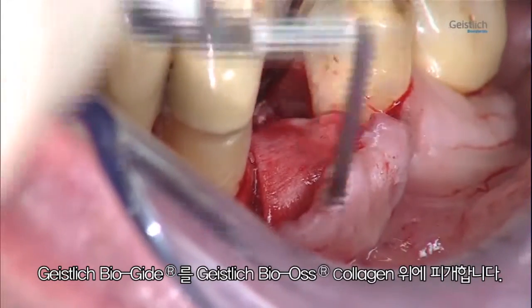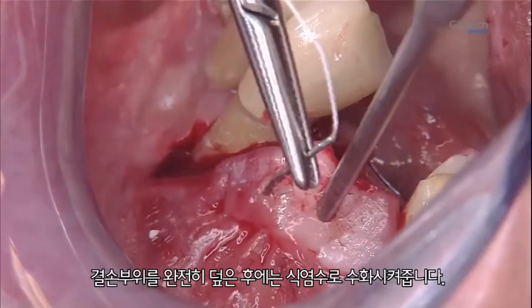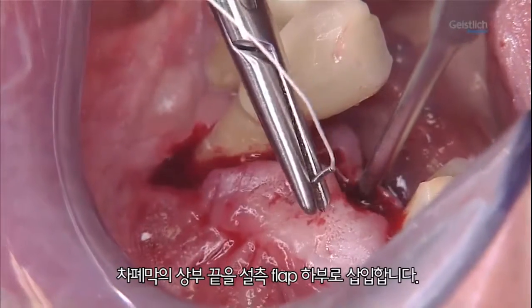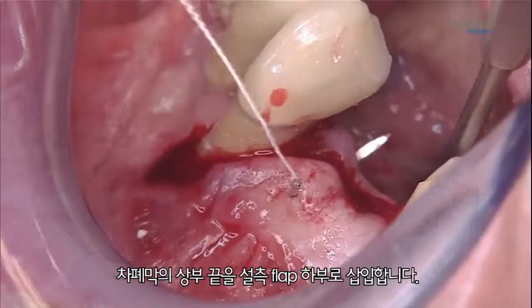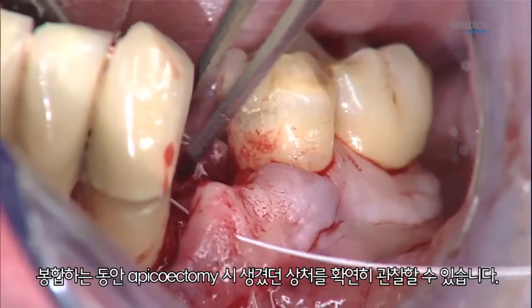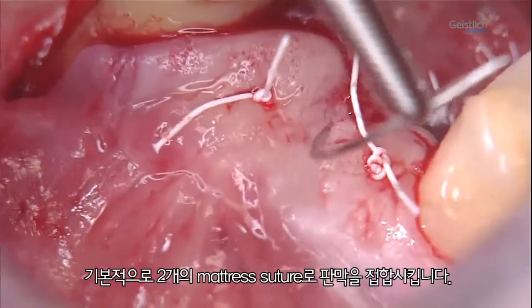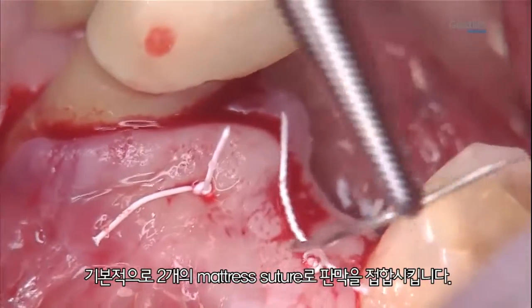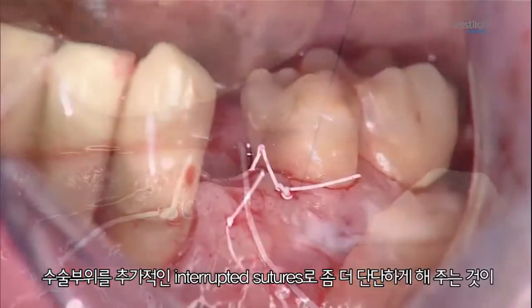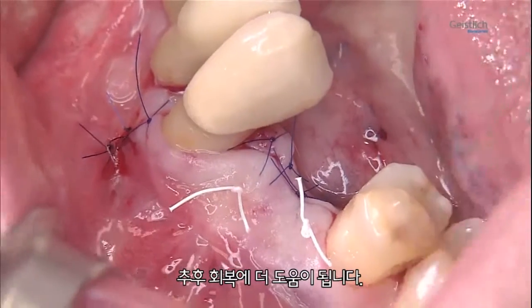The Geistlich Bio-Gide membrane is then laid over the Geistlich Bio-Oss collagen. It covers the defect and is wetted with sterile saline. The tip of the membrane is pushed under the lingually mobilized flap. During suturing, we can clearly see the vestibular scar created during the original root resection. The surgical access is initially closed for adaptation of the flap edges with two crestal mattress sutures. For further healing, it is advantageous if the surgical area is tightly sealed with additional interrupted sutures.